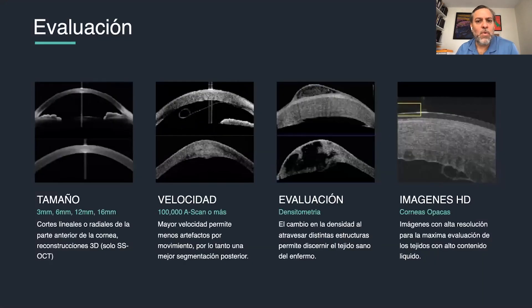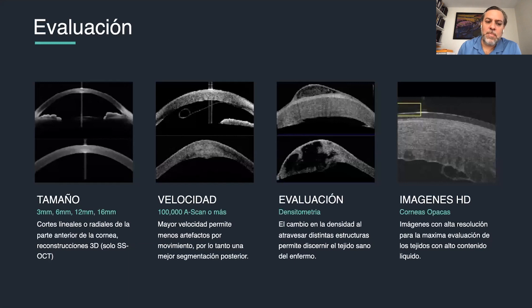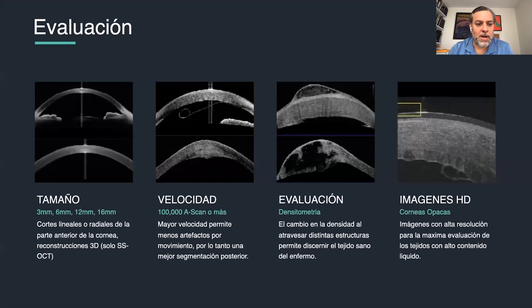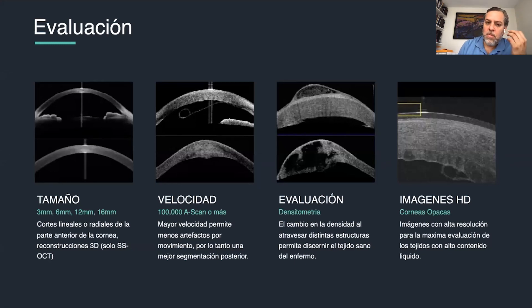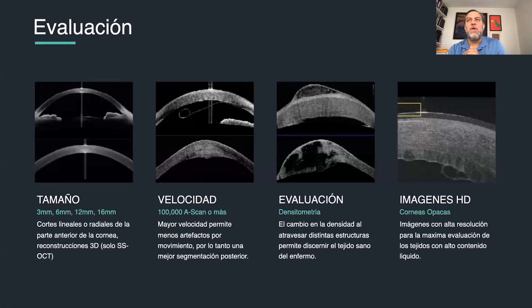Looking at clinical applications, you can perform B-scan evaluation of the anterior segment with 3 mm, 6 mm, 12 mm, and 16 mm lines — covering the whole cornea and even the eyelids. Speed is crucial: time domain OCT started at ~2,000 A-scans/second, spectral domain reached 50,000 A-scans/second, and swept source can do up to 100,000 A-scans/second — faster acquisition means less background noise and fewer ghost images.